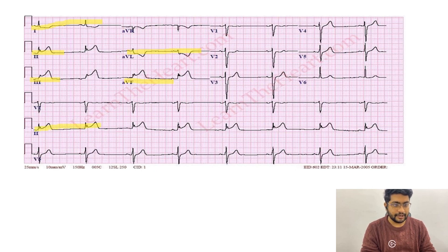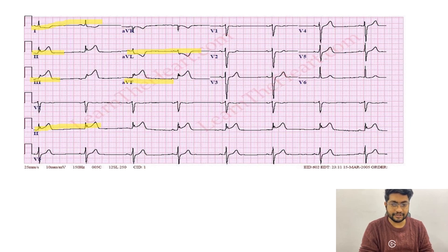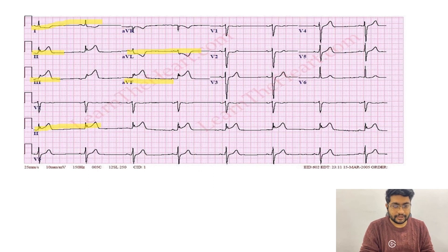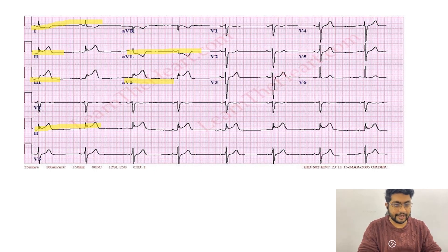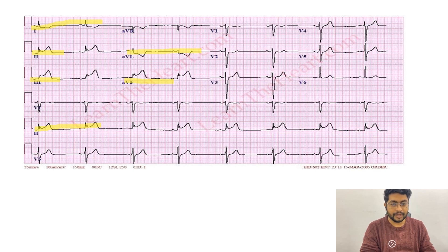Lead V1 to V6 is almost normal — there is no ST segment depression or elevation in the anterior leads. So this is an ECG of inferior wall STEMI, in which we have ST segment elevation in lead 2, lead 3, and lead AVF, and we have reciprocal depressions in lead 1 and lead AVL.